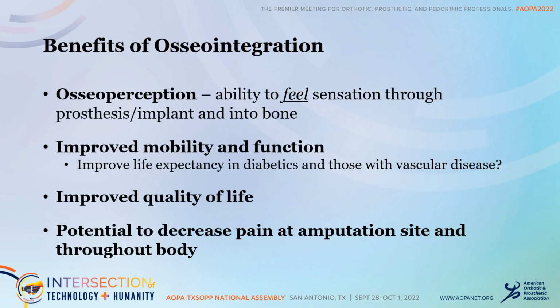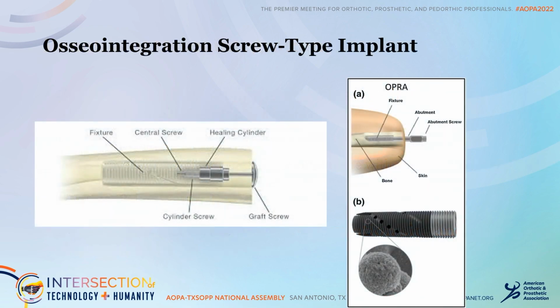The benefits of osteoperception, being able to feel where their limb is in space, and having improved walking mobility and confidence in their walking and overall improved quality of life is just super impactful for the right patients.